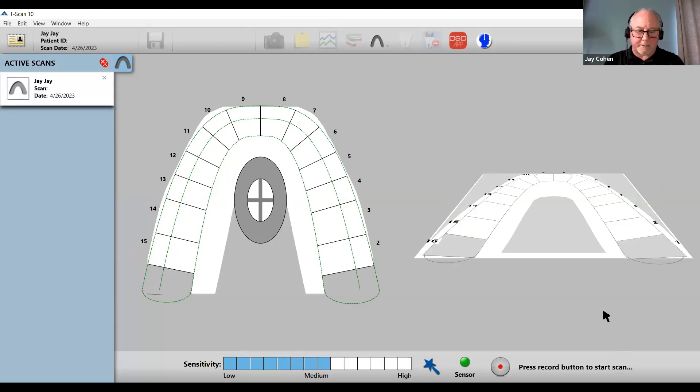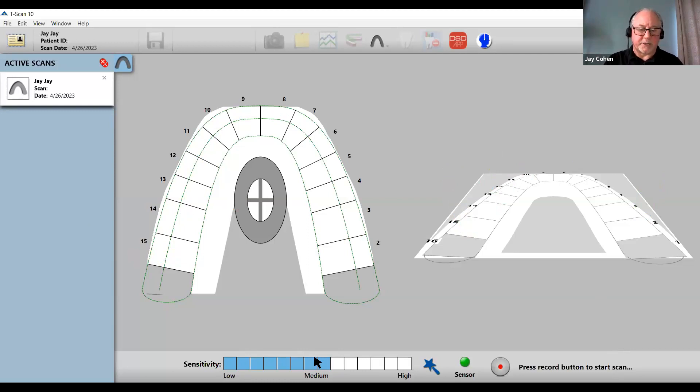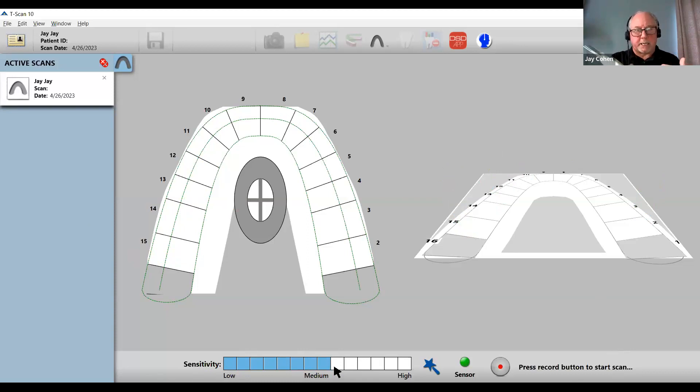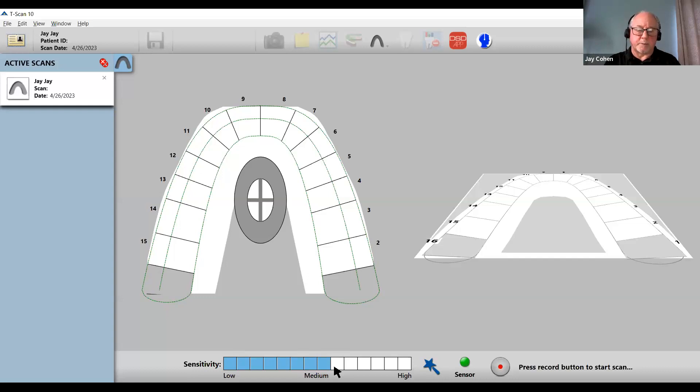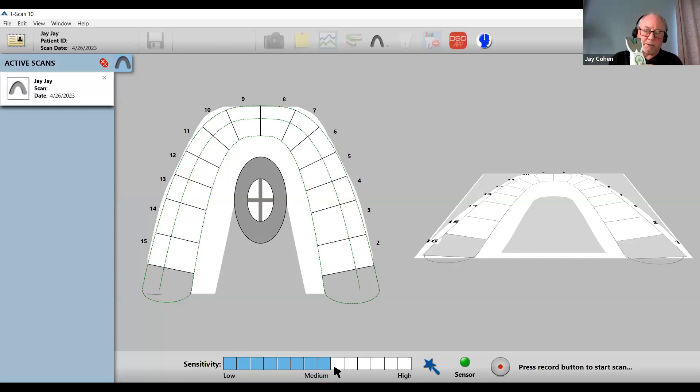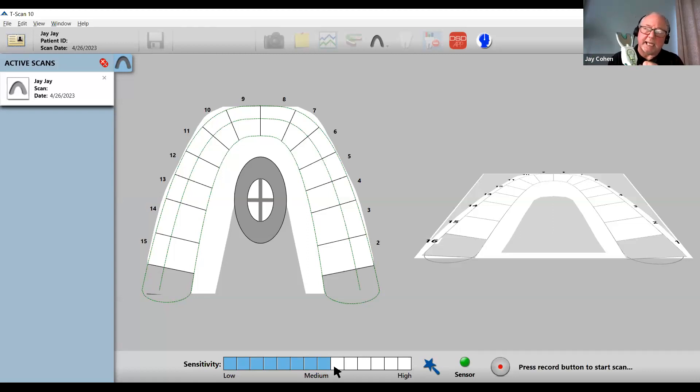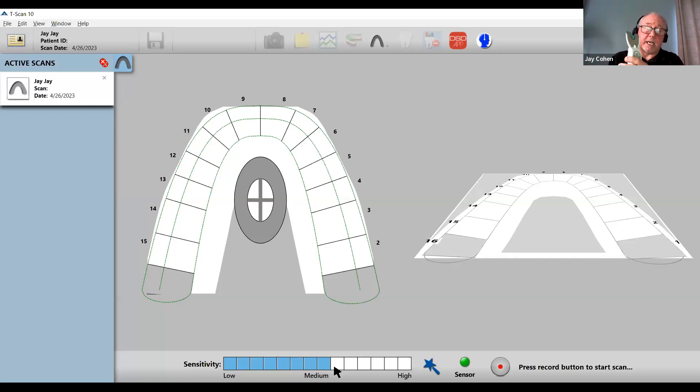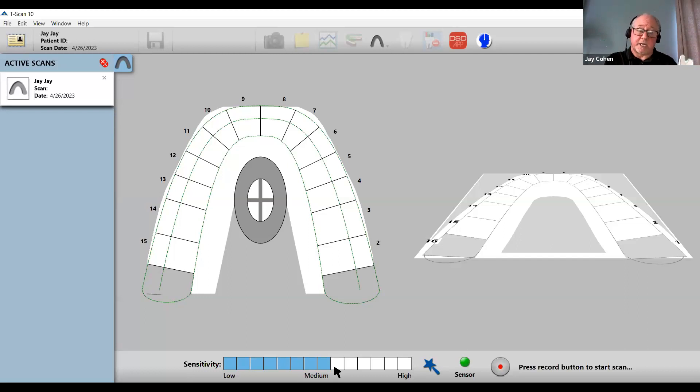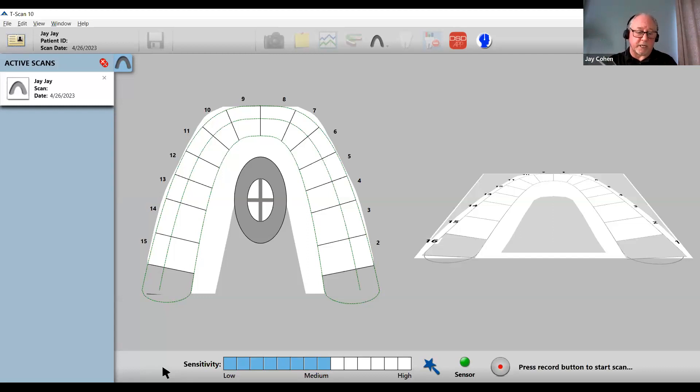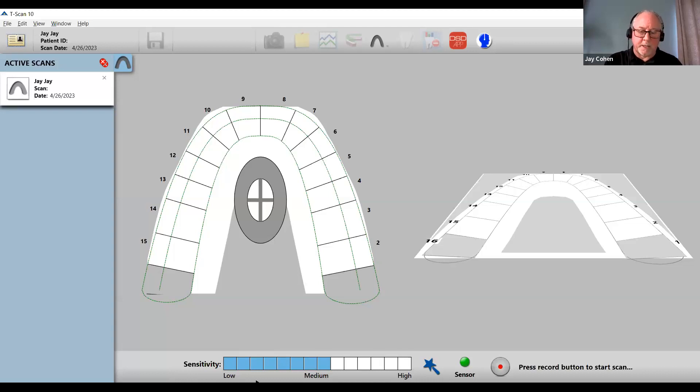Once we establish that, we're ready to make a recording. That's the manual process where the patient clenches, you click on the screen to what level you want, and you continue that process until you reach the optimum level. There's no perfect setting. The other method is using the wizard.